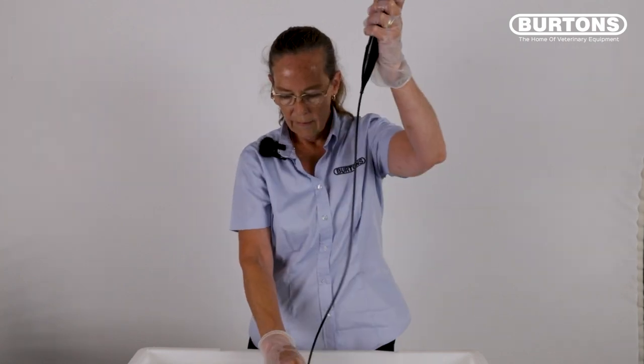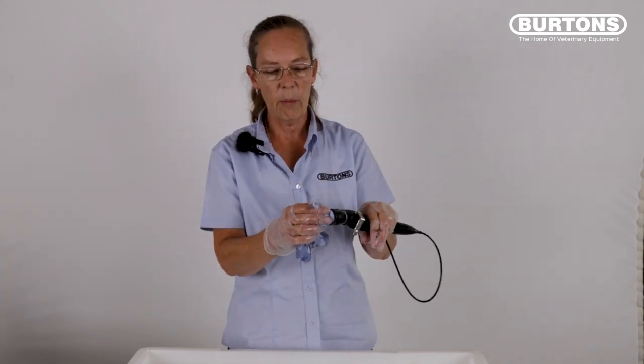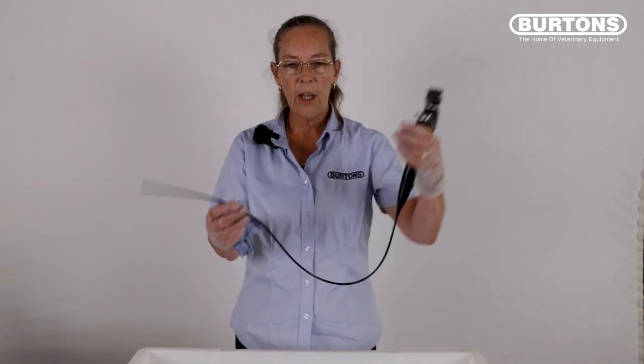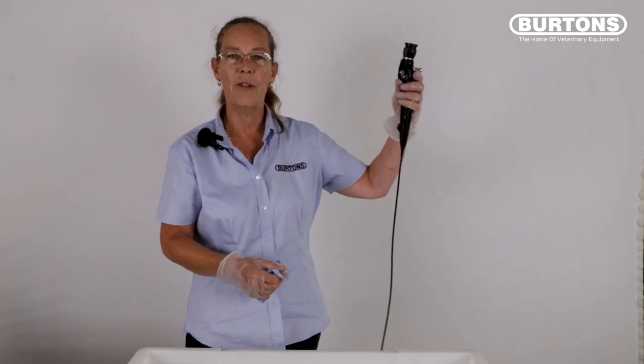Reconnect your adapter and use some lint-free tissue to dry your endoscope. Pay particular attention to the lenses at the proximal end and the distal end to make sure you're not leaving any trace elements of pathology or disinfectant, which can cause cloudiness on the scope. The scope is now ready to be stored hanging up until the next time you need to use it.